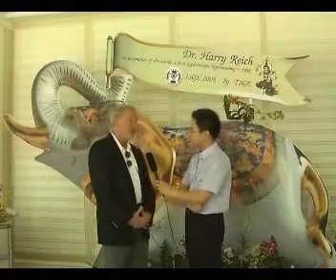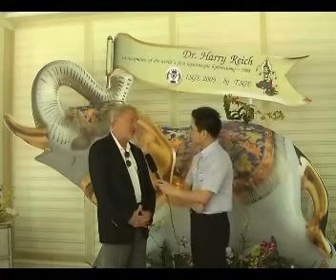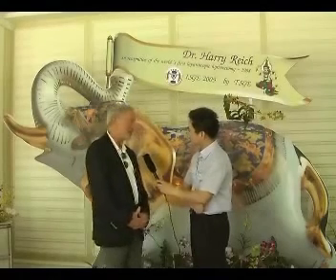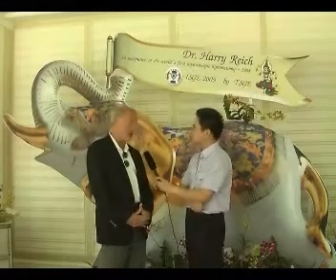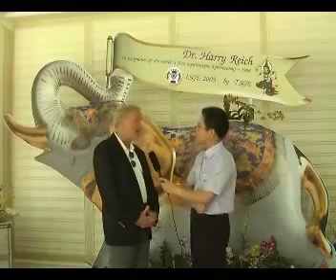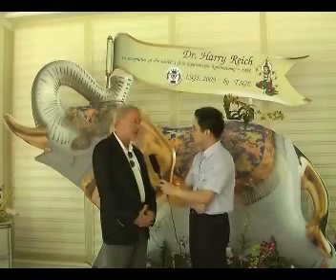But in January 1988, I had some students from Massachusetts who came to see surgery. I only had one case, a large fibroid uterus, and I decided to do the whole thing laparoscopically. Before that, I would just do the upper part laparoscopically, but in this case we did the uterine arteries, and then we opened the vagina where it met the cervix laparoscopically. Before that year was out, we did everything laparoscopically, including suturing the vaginal cuff, which to me is the most important part of the operation, now known as total laparoscopic hysterectomy.